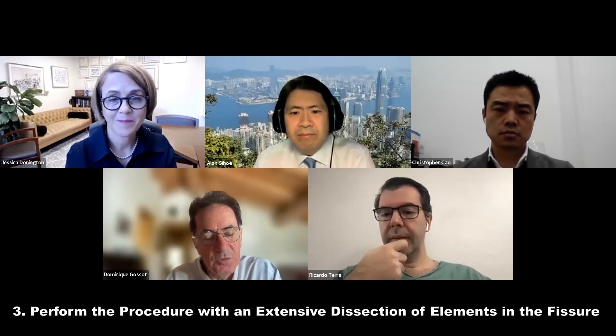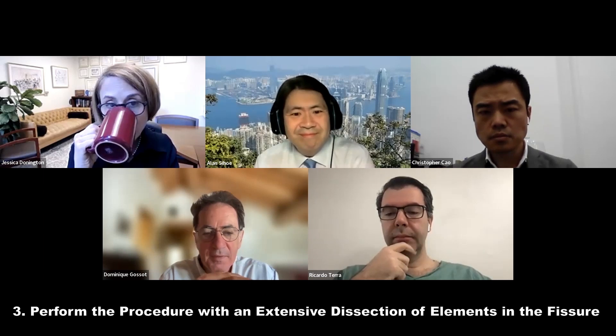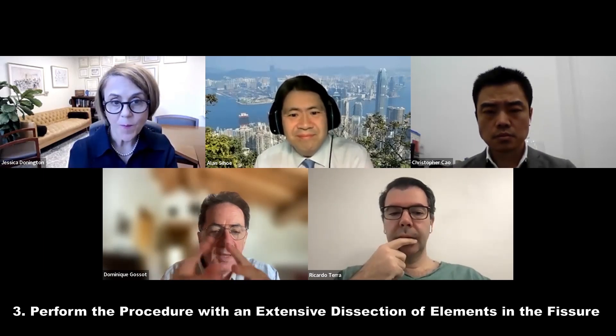So that brings me to the third tip: even if you have a good 3D model, you have to perform this procedure with an extensive dissection of the elements in the fissure, so that you have a very good exposure and clear view of all the vessels and bronchi. So just not rely on the 3D model, but perform a good dissection in the fissure. For this surgery, there is no place for the so-called fissure last technique — this should be a fissure-based technique. And I hope this is something you can understand if you watch the video.